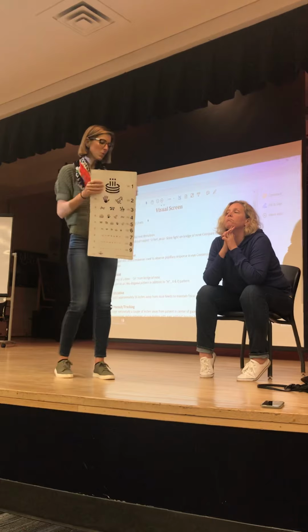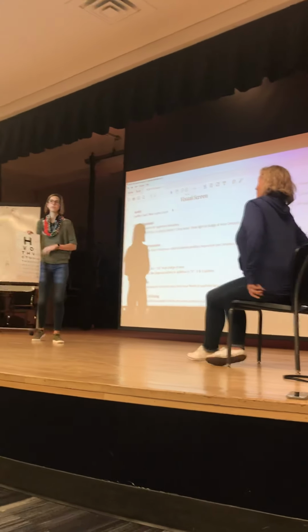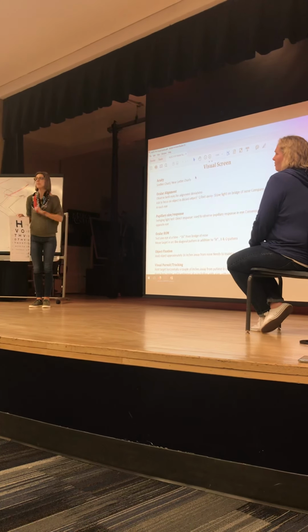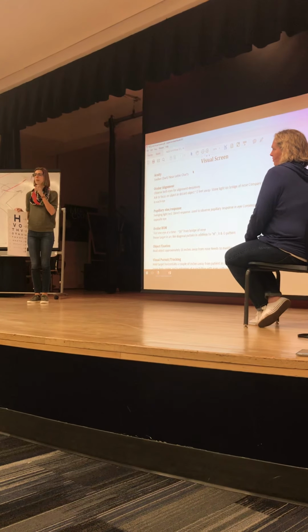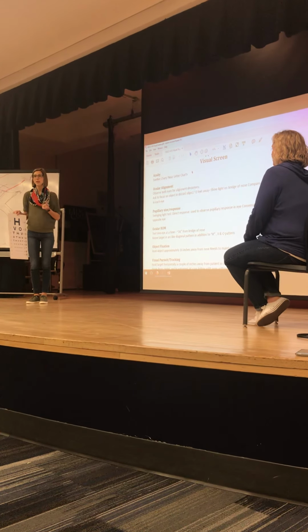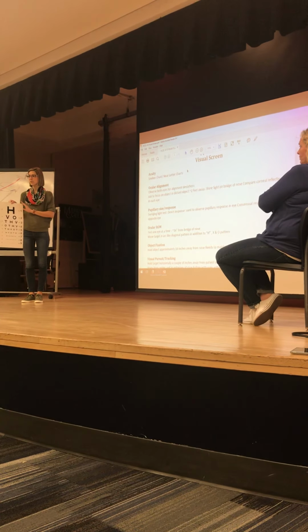All right. So actually, Steph, what we're going to do is you're going to face them this way. We're going to imagine that this is 10 feet away. As occupational therapists, if the patient comes to you and they have glasses like myself, I'm going to test their best corrected vision. So acuity is the only test where we will leave the glasses on. For acuity, I will test the eyes monocularly and then binocularly.